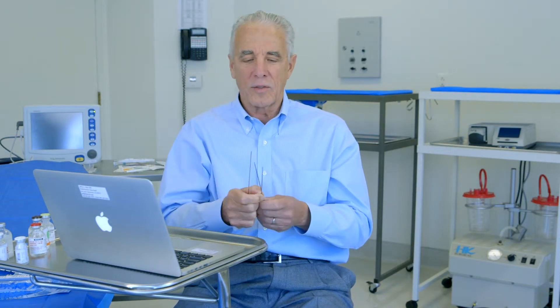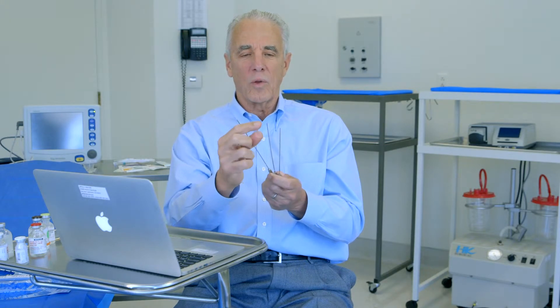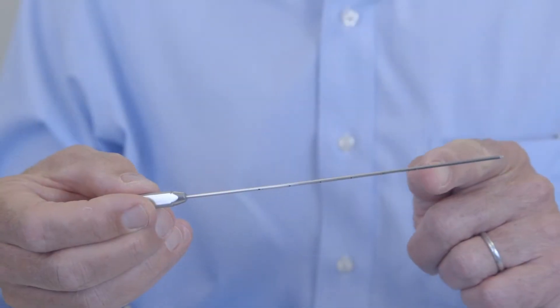We have designed tumescent lidocaine anesthesia cannulas specifically designed for our tumescent infiltration. We've called these Monty cannulas. This is a hole cannula with holes that come down to this far on this blunt-tipped cannula. This one has holes that come down about halfway, and these come down all the way down to here. These are used in a very specific fashion. This is the Tip Monty, a Half Monty, and the Full Monty.